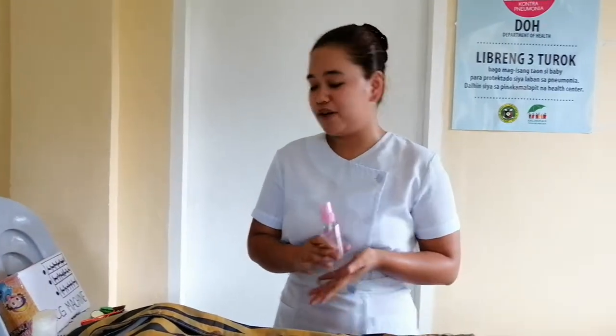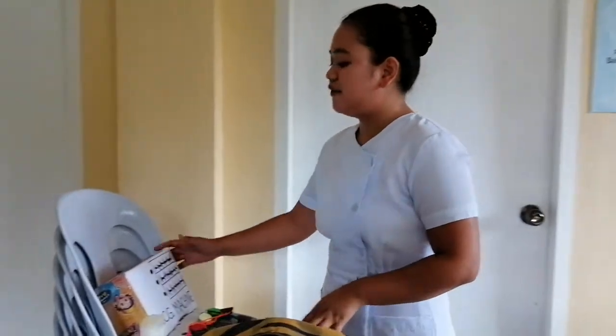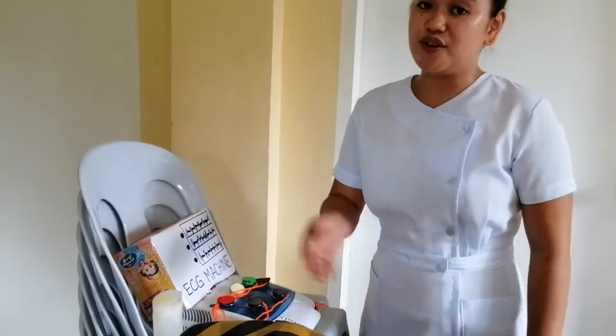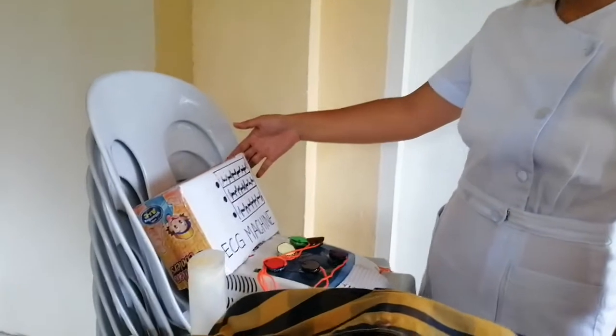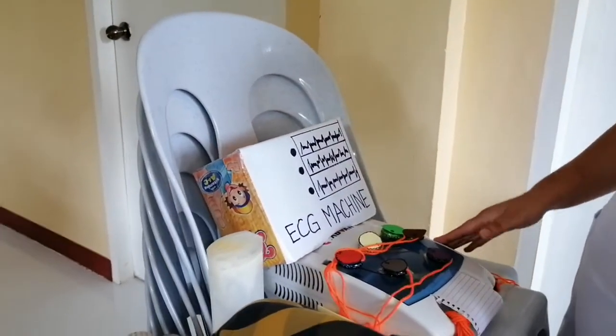I also have here alcohol to sanitize my hands to prevent the spread of microorganisms while performing the procedure. And I have an improvised ECG machine, since I don't have one. I have a box as the ECG machine and also a nebulizer as a substitute.